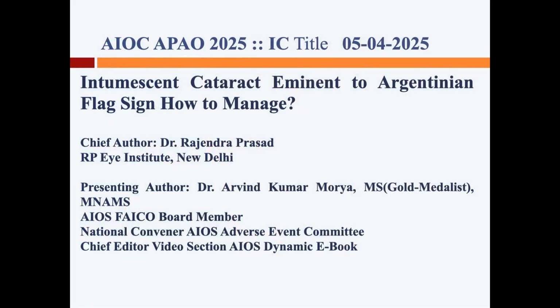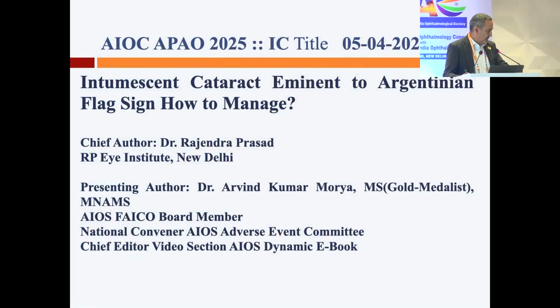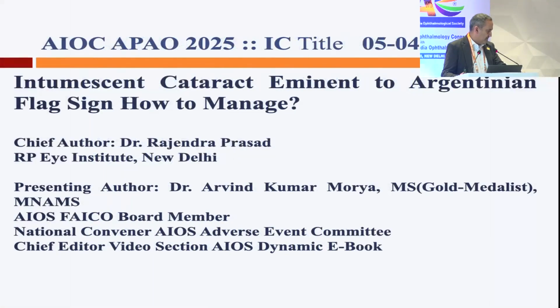Meanwhile, Dr. Tamjid, what's your choice of lens in myopic LASIK? You told us you choose negative spherical aberration lenses, so which lens do you prefer? For myopic LASIK, you have to use an IOL with negative spherical aberration. For me, I use the Tecnis IOL. Tecnis has the highest negative sphericity, around minus 0.27. Yes, that's the highest negative sphericity. Exactly. Okay, thank you.